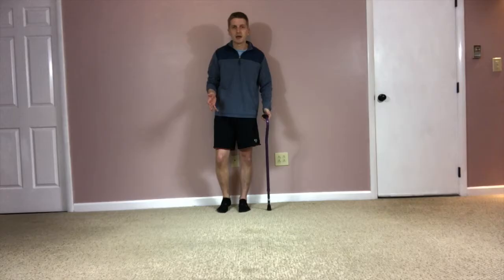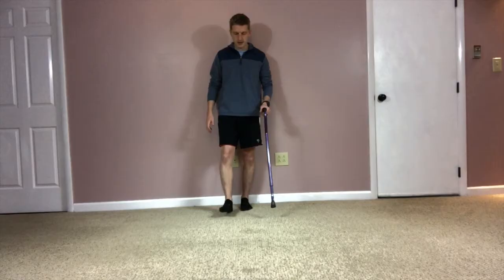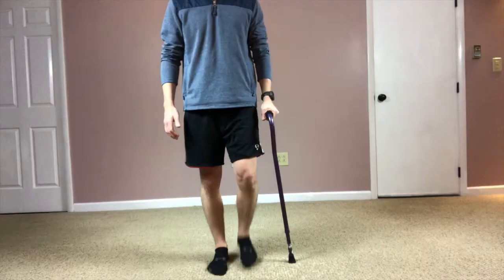There's a couple ways to do it, but probably the most common way is to start with the surgical side, and the surgical leg and the cane are going to move together. So it's cane and surgical leg, and then you're going to step with the other leg. Cane and surgical leg, and then the other leg.